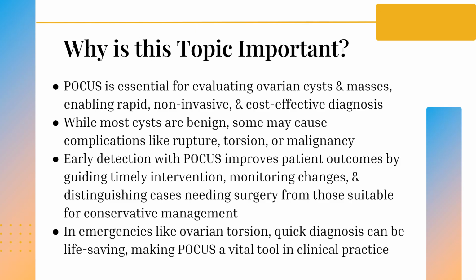This topic is really important because in general, point-of-care ultrasound allows nurse practitioners, midwives, physician's assistants, and care providers to recognize quickly on a bedside ultrasound: is it a cyst, is it a mass, what's going on, and then you can make a quick decision based on those results versus having to send them out to radiology and wait for that ultrasound to be done and interpreted and sent back to you, depending on how busy their schedule is.